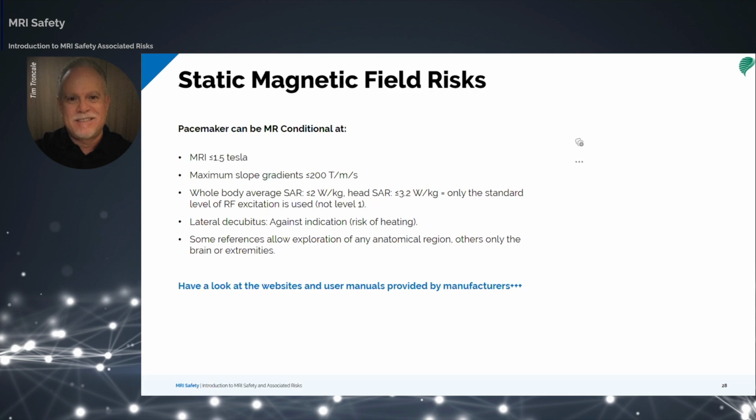There are pacemakers in production that are MR conditional. However, even they must be scanned only under certain specific conditions as specified by the manufacturer. Some institutions may even scan patients with conventional pacemakers, but this is typically on non-pacer dependent patients with the proper cardiac personnel and monitoring equipment.